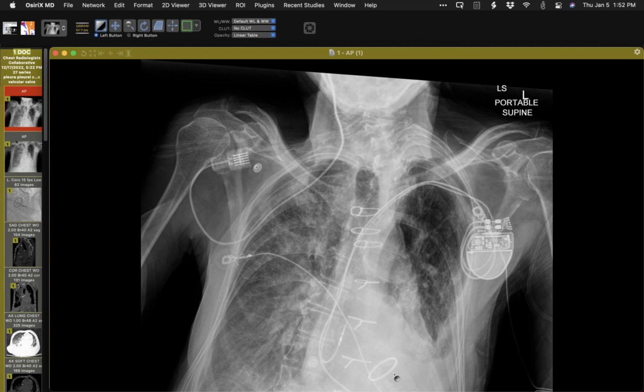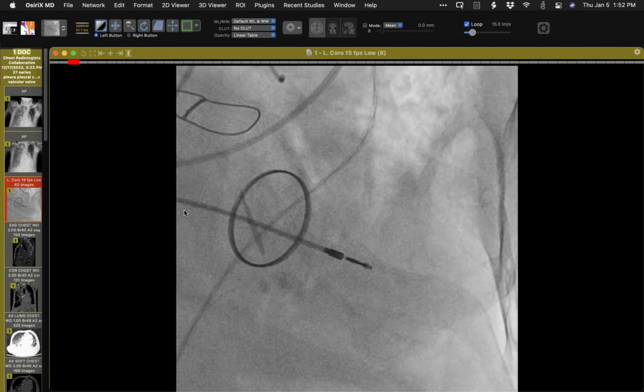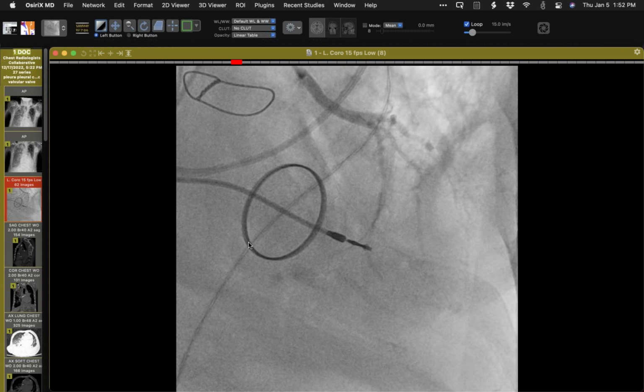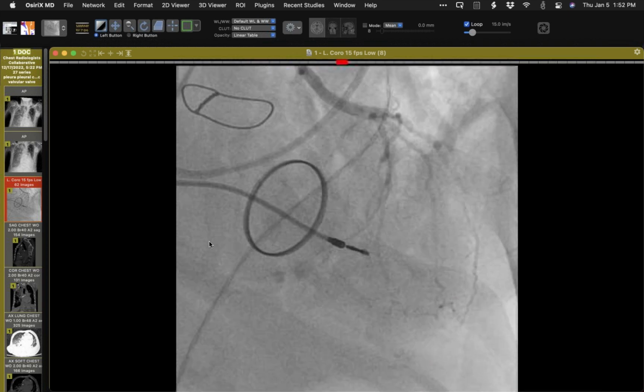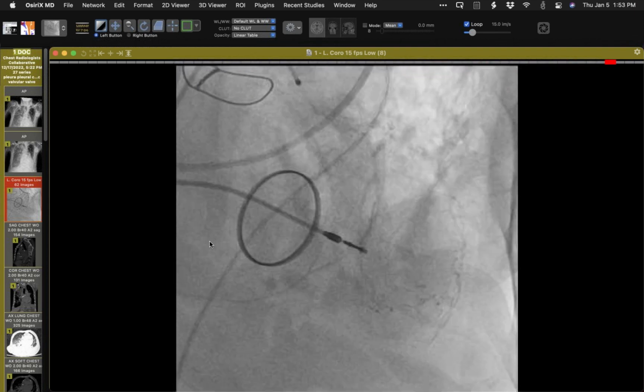But one interesting finding on quite a few radiographs was that there was only one leaflet of this mechanical valve that was imaged as a discrete structure. And here you'll see why. So when they did the coronary cath, you can see here they're doing coronary angiography, but the operator clearly was, for a moment at least, focused on this valve. And you can see here that the valve appears, the leaflet appears, I should say, but only one.